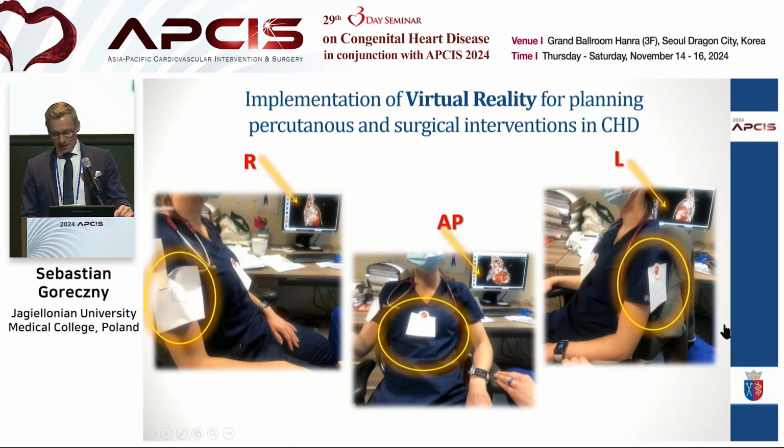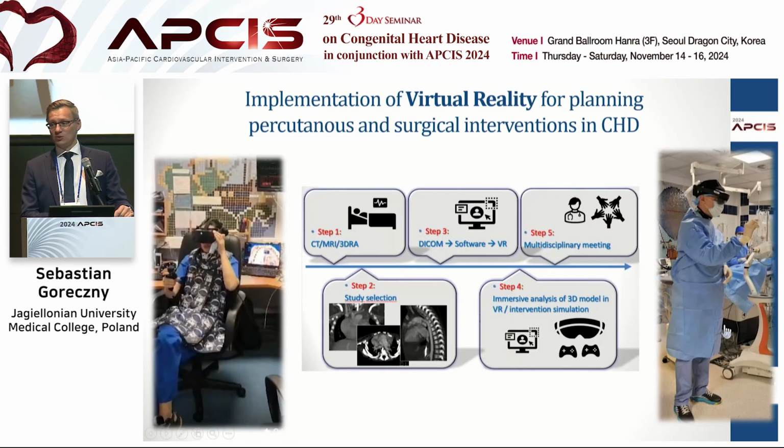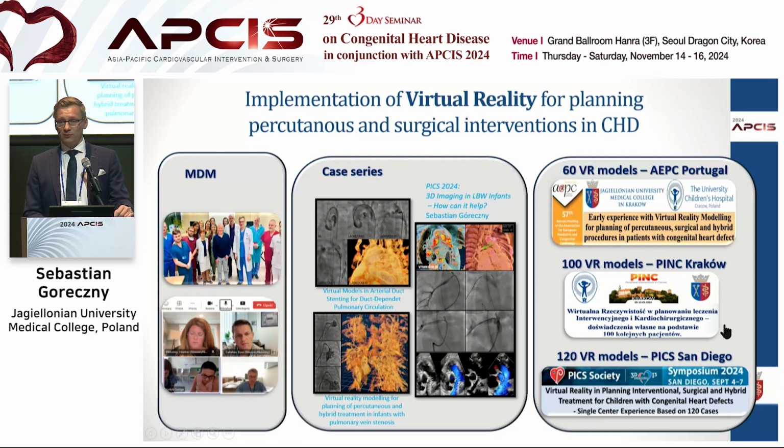So a couple of years later, we introduced virtual reality to the planning of our interventions. So we do use goggles in a cath lab. Sometimes we use goggles during our cases. So again, this is an example of fusion or combination of different modality techniques to perform cardiac interventions.